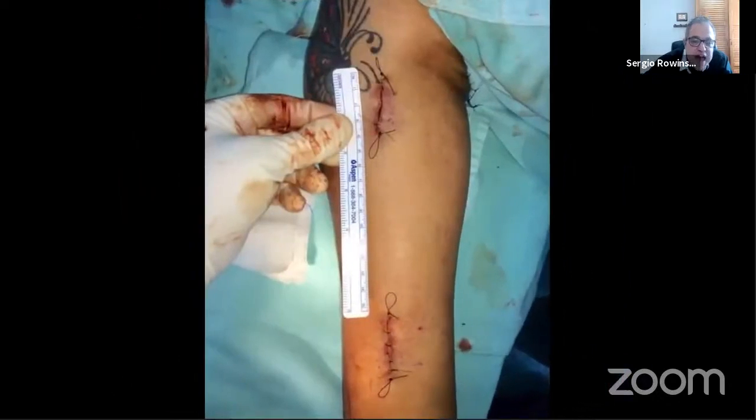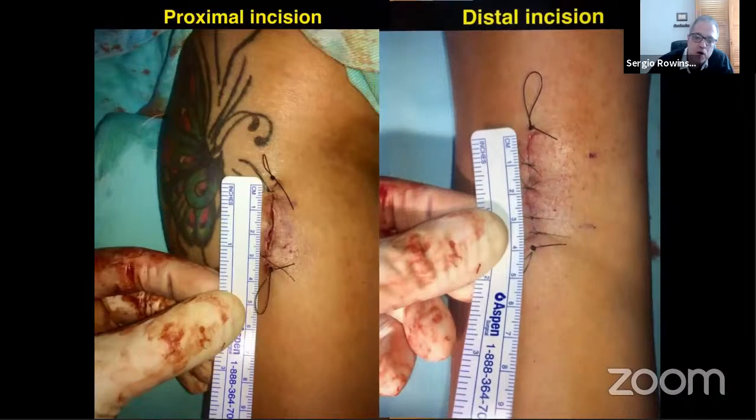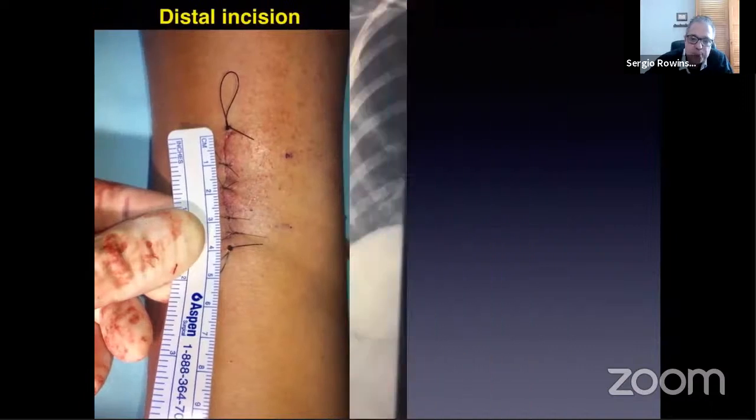I do very, very small incisions. People always ask me, how can I do such small incisions? I'm gonna show you. This is the proximal, as a rule, 3.5, distal 3.0, but for some reason that I don't know, there is a shrinkage in the distal incision, it becomes very small.